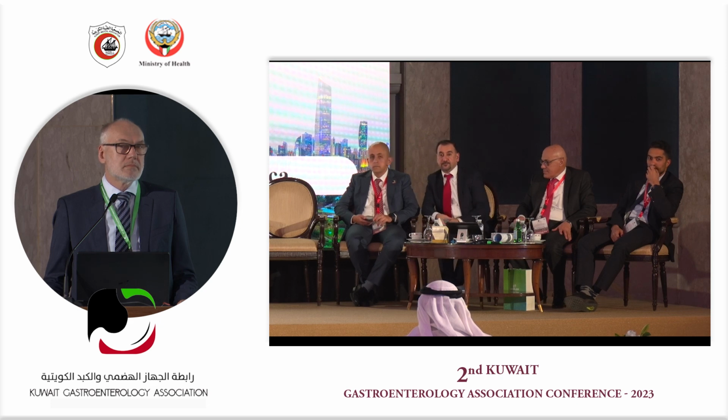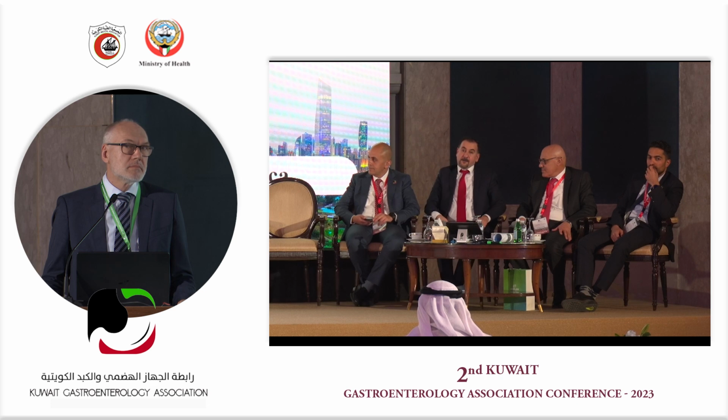I thought they are not putting the stitches opposite each other, so this will cause the twisting and cause the leak. Is that so?